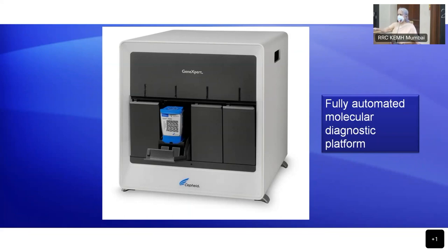So this particular instrument does away with all that. You are loading one sample inside and shutting it. So you shut it, forget it. Then there is no chance of contamination because of amplicon, because it is a closed system. There is no chance of contamination because of target, because target extraction takes place inside the cartridge. So everything is a closed system, and therefore it avoids the problem of contamination totally.